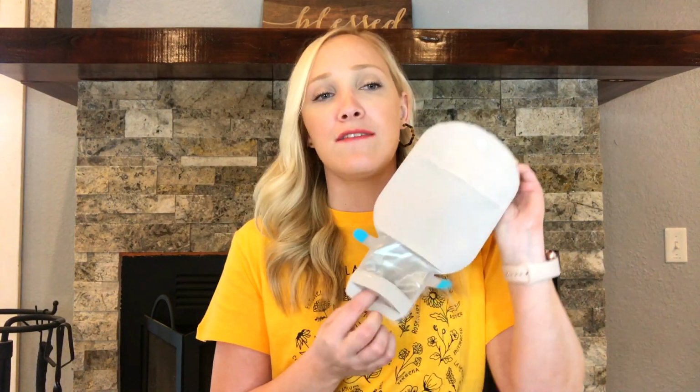Well, I wish that she would have had a conversation with me. Hey, Amber, you have an ileostomy. You may be more active, especially since you just had surgery. Maybe it just slipped her mind. I'm going to give her the benefit of the doubt, but she probably should have given me a drainable pouch. And this is not even the smallest drainable pouch they made.